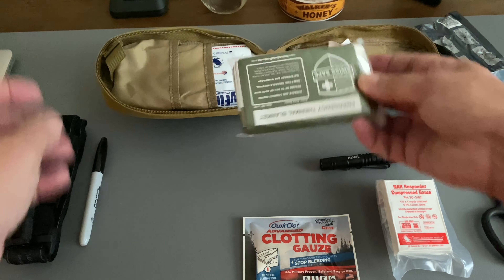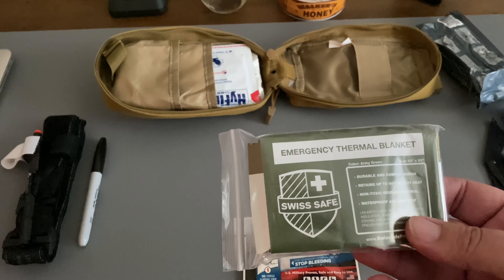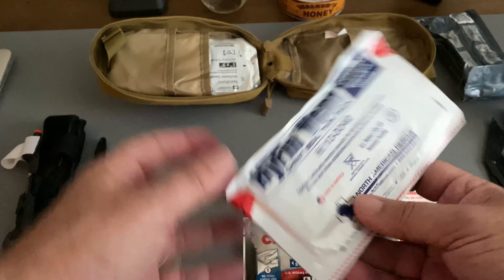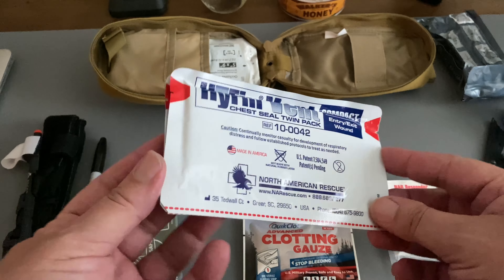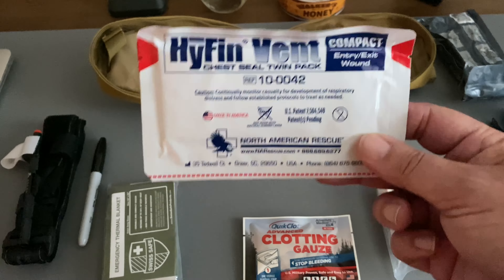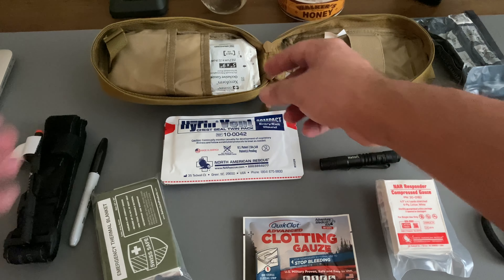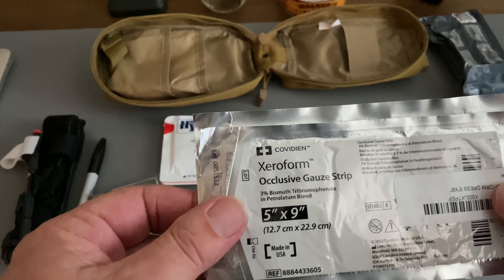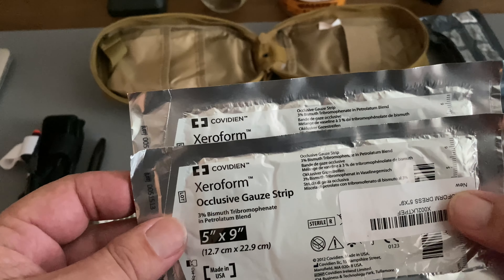We have of course a Mylar thermal blanket to help with hypothermia. We also have HyFin chest seals — two of them, the compact ones. You always want two: one for the entry wound and one for the exit wound. And I also have two of the occlusive gauze strips.